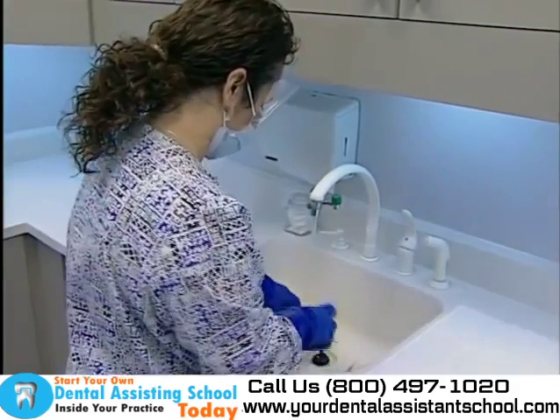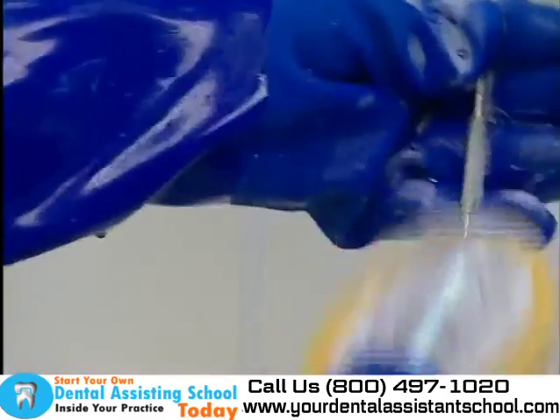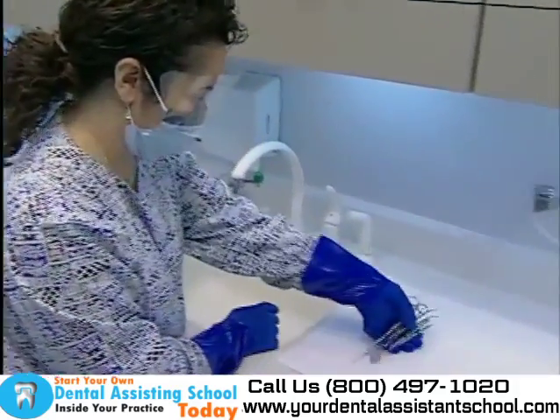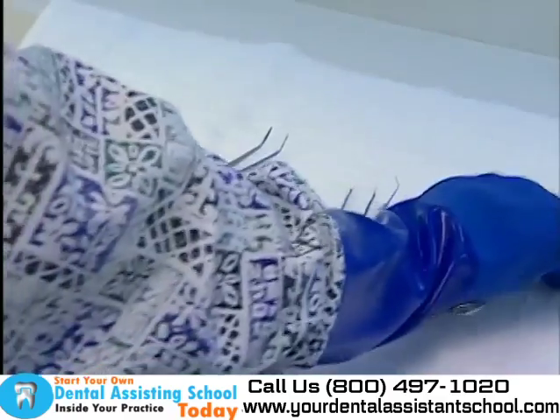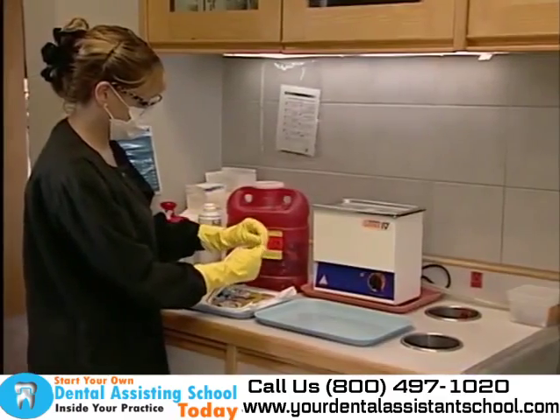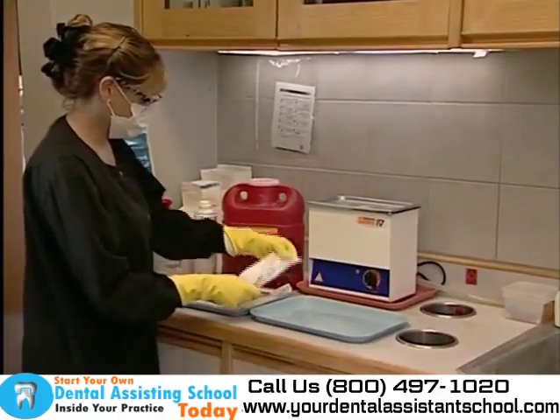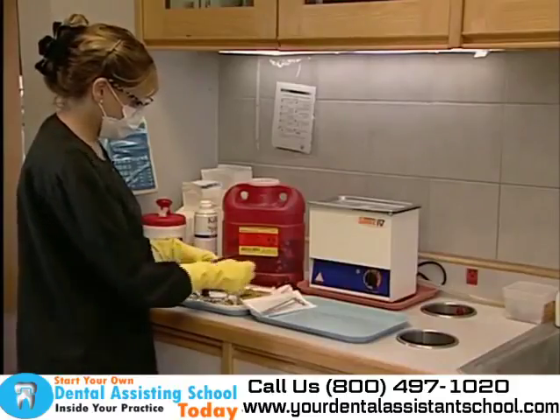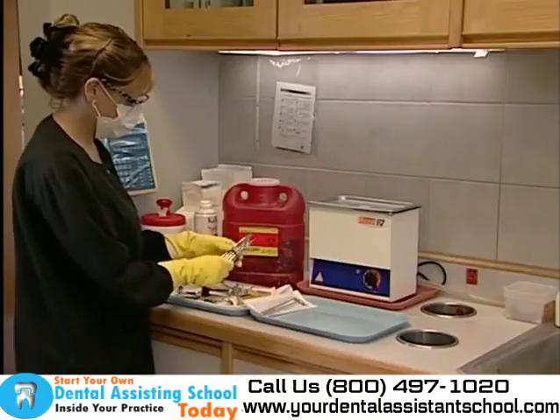If scrubbing by hand, scrub underwater, pointing the spray away from you, and wear utility gloves. Once cleaned, the instruments are rinsed thoroughly in tap water and then dried on a towel. When dried, they are put into a sealed and labeled bag in sterilization pouches or placed into cassettes. Sharp tips may be wrapped in gauze or foil to prevent puncturing the bags.